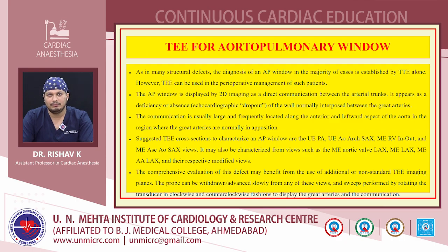Here we are not only looking at the views as classically mentioned, but we also have to perform sweeps of the TE transducer from left to right. We may need to anteflex and retroflex, or we may need to even withdraw or advance the probe so as to obtain continuous views of the structure of interest. So that is one of the main important characteristic features of the TE examination of these lesions, so as to obtain a proper idea regarding the anatomy and the physiology of the lesion.